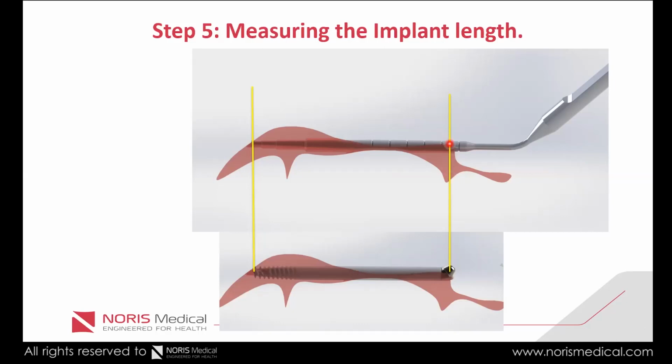Now, because the multi-unit is about between 2.5 to 3 millimeters, depending on the multi-unit, away from the implant platform, that means that we have to reduce this distance. Okay, so we are going to reduce 2.5 millimeters from the measurement that we have. Okay, so for this implant, actually, we're going to count the lines: 1, 2, 3, 4, 5 lines, or 5.5, or whatever.